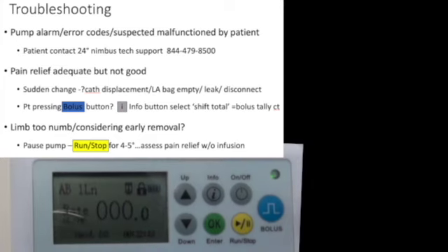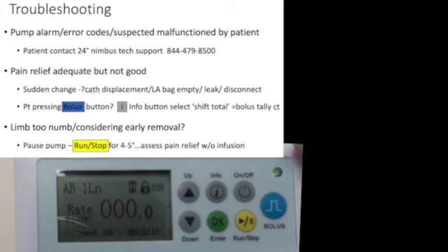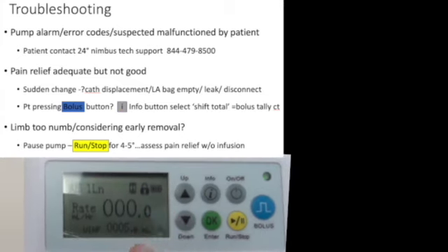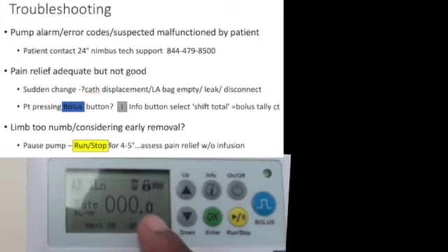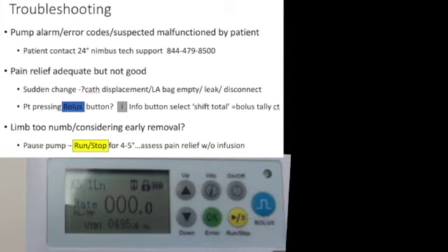For troubleshooting: the green LED flashes for 10 minutes when the pump is running. It will flash red if there is an error, and the error code will be displayed on the screen — asking the patient about this can help troubleshoot. If the LED is completely red, the pump is not working at all. If the infusion is complete, the screen will display 'infusion complete'.